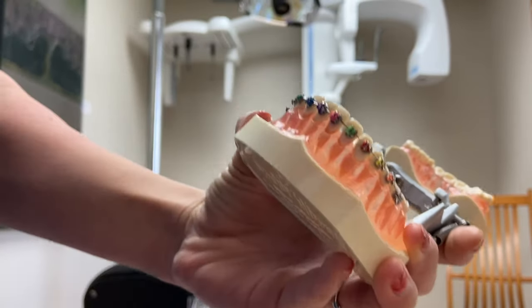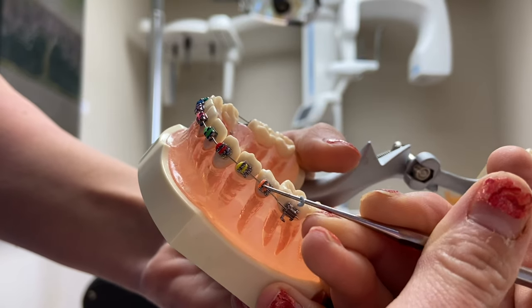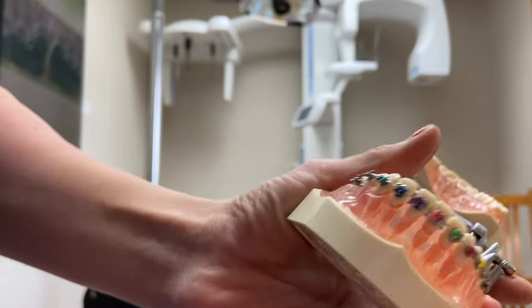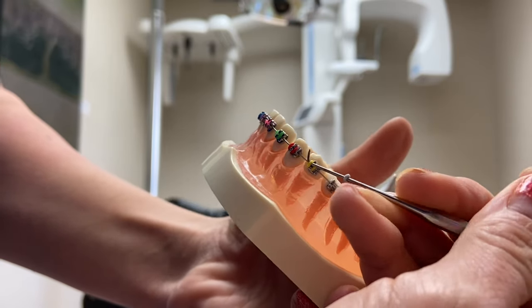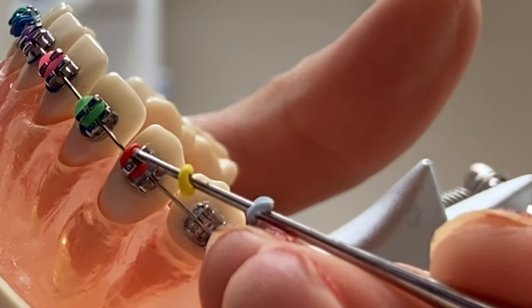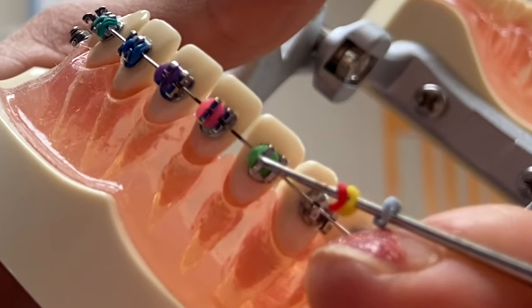Alright guys, so I hope I'm in the frame here. So we have an orange one — we're going to take it from the side. It's hard to do it on this type of model. And then you're going to... oops, I just broke it. These are really old ties, so that's why it just broke. Let's try this one. I'm going to take it from the side and you're going to pull down. I don't want to rip the bracket off. I hope you guys can see this — I'm trying to watch what I'm doing and do this at the same time. It usually doesn't take this long, but I'm being careful.